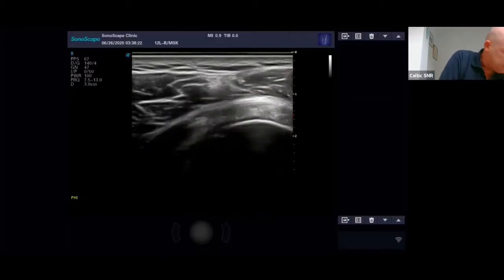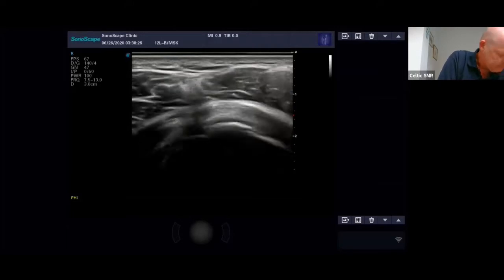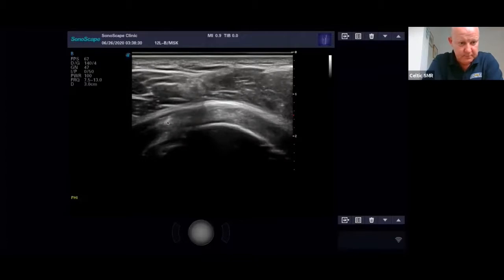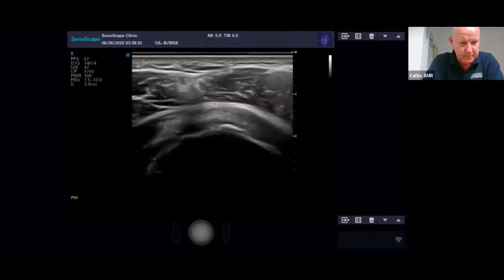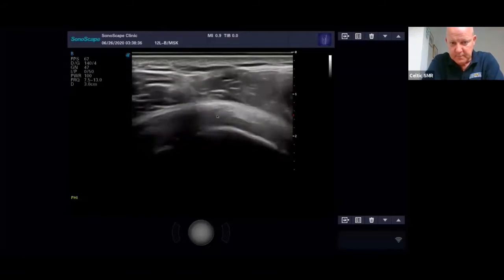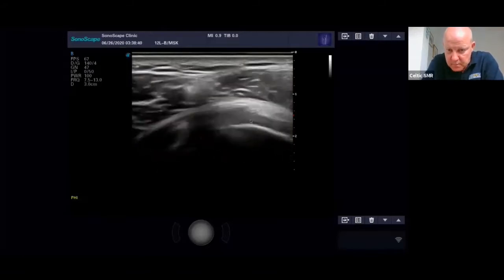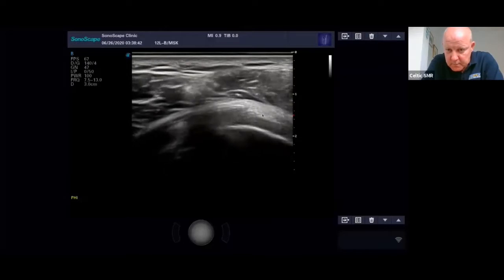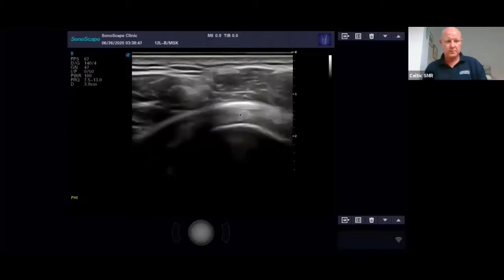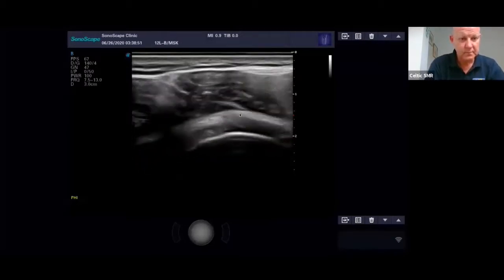So when you move the probe backwards and forwards, you see this bright bit here. If I move backwards and forwards, that's going that way, so I know that's coming from over there. And this one, if I move backwards and forwards, it's coming from over that way. So you can differentiate that way, if you see the fibers well enough.